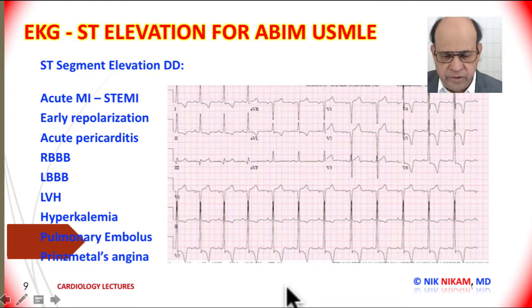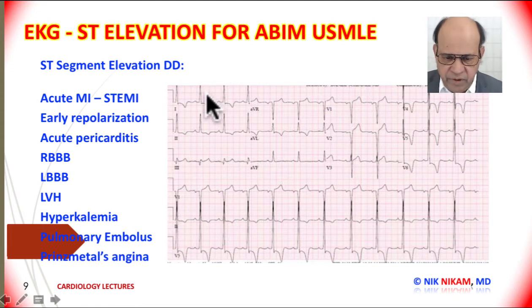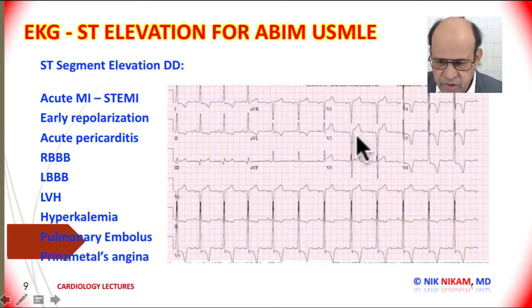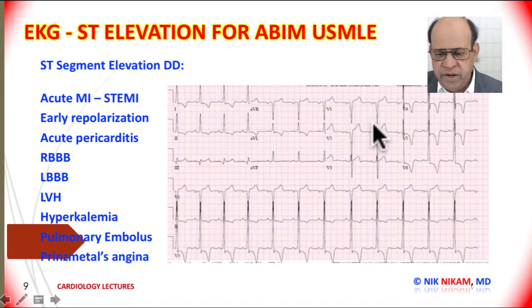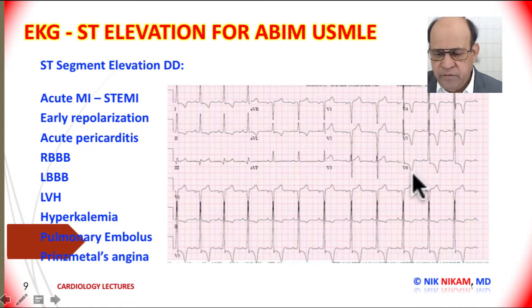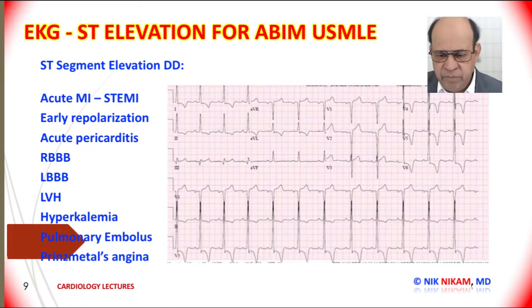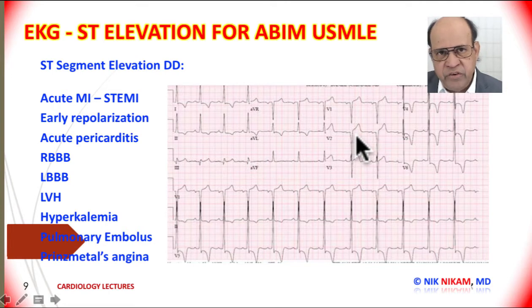Do you see ST segment elevation? In this electrocardiogram we see some ST depression, but also ST elevation in V1, V2, and V3. Along with that, we have increased negative voltage in V2 and increased voltage in V6, and left atrial enlargement. We are dealing with an electrocardiogram reflecting left ventricular hypertrophy with strain, which also causes ST segment elevation in the anterior leads. This is important to remember because when these patients present with chest pain, we may mistake this for an acute STEMI.